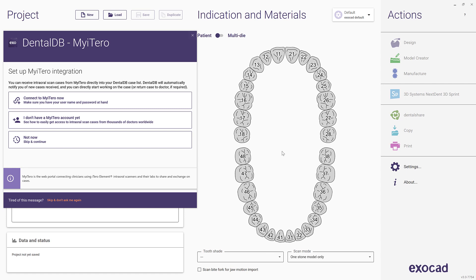Did you know, starting from ExoCAD's latest release, DentalCAD Galway, the DentalDB software will present a pop-up window inviting you to set up My iTero integration.